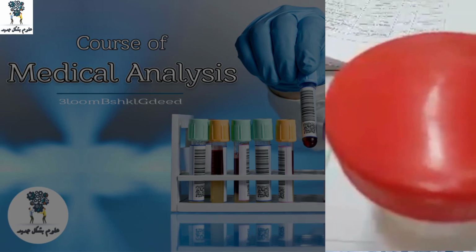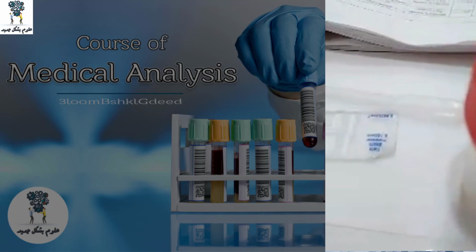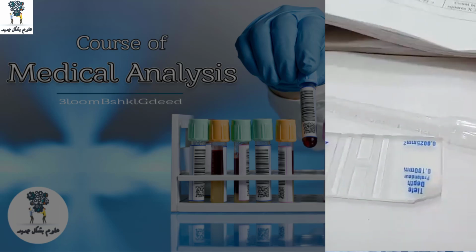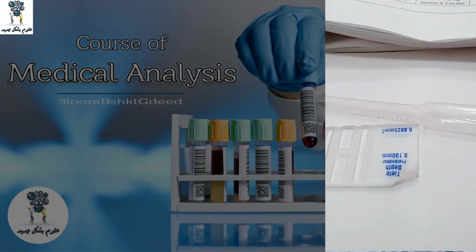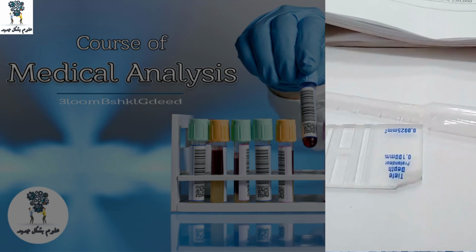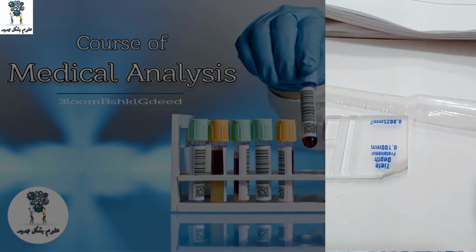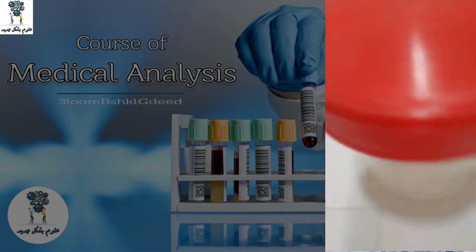If there are no sperms in the first slide and no sperms in the hemocytometer, and you make centrifugation for 15 minutes at a certain speed and you didn't find anything, then you can write with trust that there are no sperms.